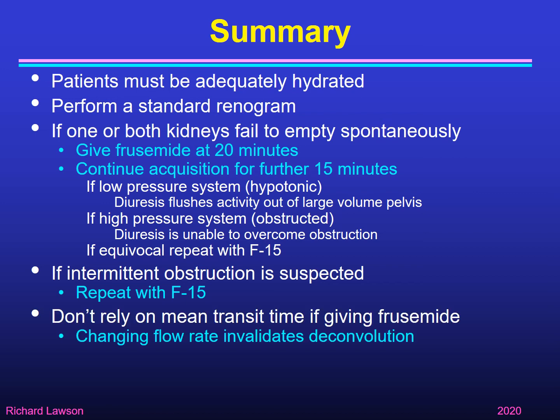But don't rely on the mean transit time if you're giving furosemide, because furosemide changes the flow rate and that invalidates deconvolution. So treat any transit times calculated in conjunction with a diuresis renogram with a pinch of salt.